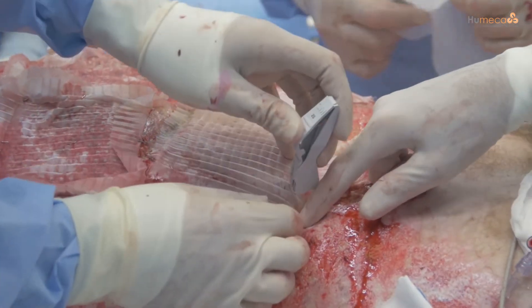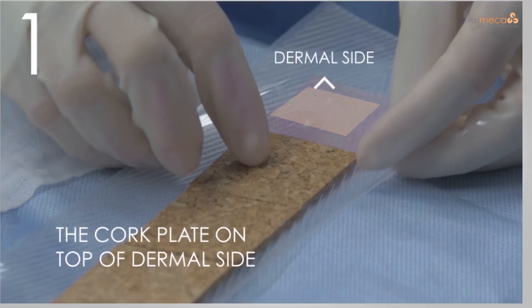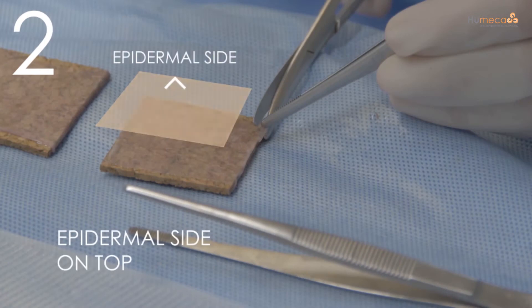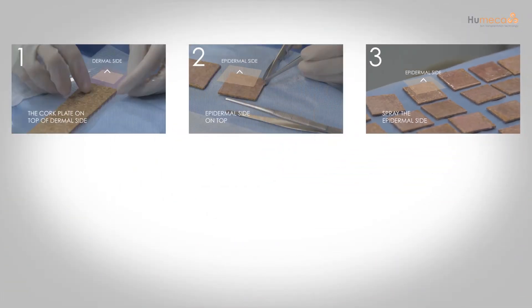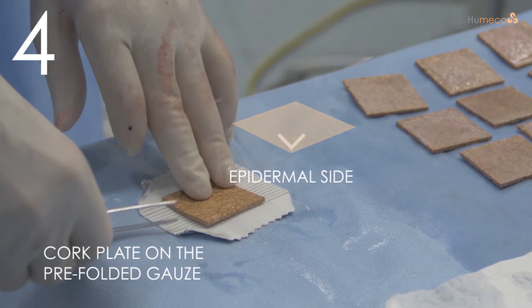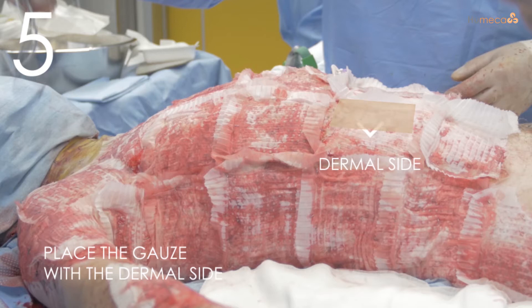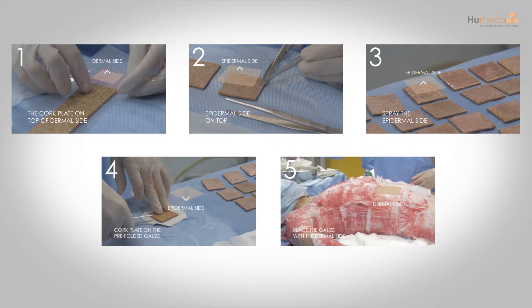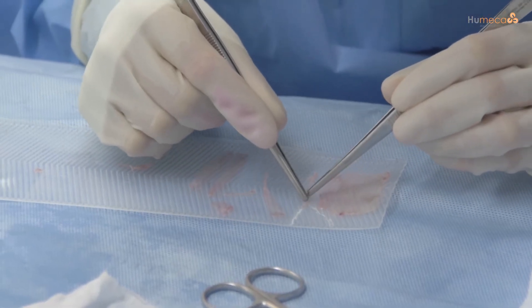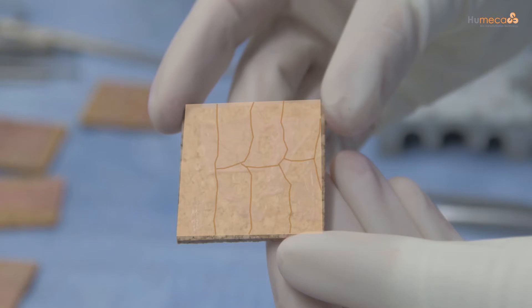Always make sure that the dermal side is against the cork, so that you will end up placing the skin islands dermal side down on the wound bed. Place the cork plate on the dermal side of the skin, then turn the cork plate over with the epidermal side on top. After cutting it twice, spray the epidermal side with glue, then place the cork plate on the pre-folded gauze, taking care that it is lined up exactly on the central square of the gauze. After removing the cork plate and expansion, place the gauze with the dermal side of the skin on the wound bed. Leftover pieces of skin can also be used — no skin is wasted — which is especially advantageous in cases of extensive burns where donor sites are scarce.